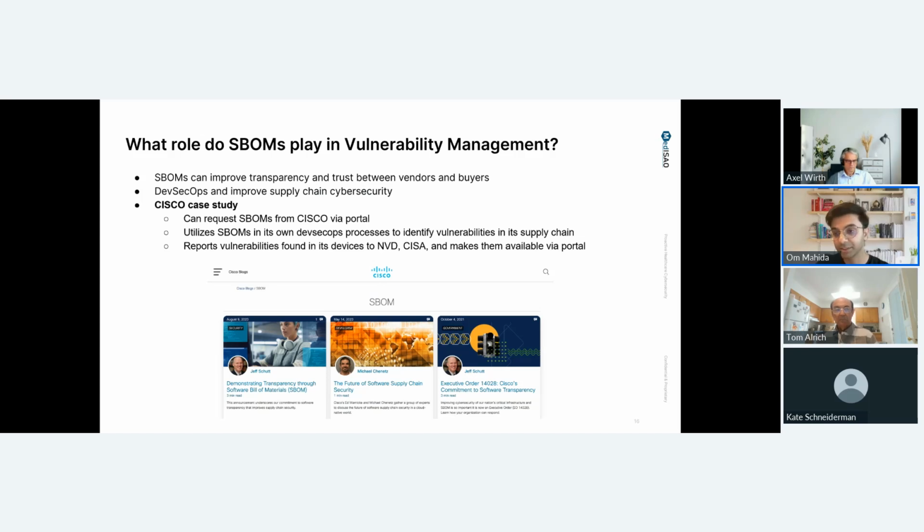And that's a really good strategy. One of the key things is we wouldn't want a hospital or clinic needing to monitor 10 different feeds to really understand what they're vulnerable to and what they need to patch. Taking an approach where you're both publicly making data accessible and easily findable, while also making a very clear path to actually get access to the patches or any other information, are really important paths for a device manufacturer to take.